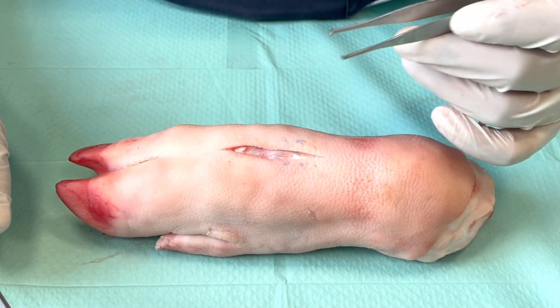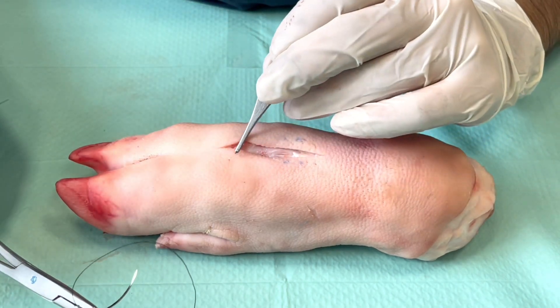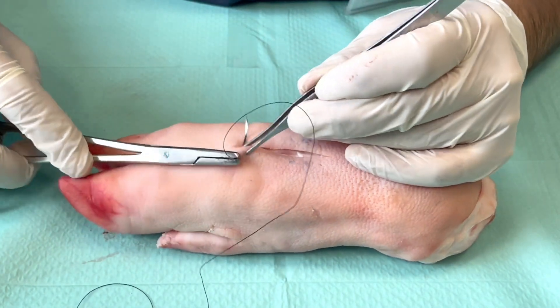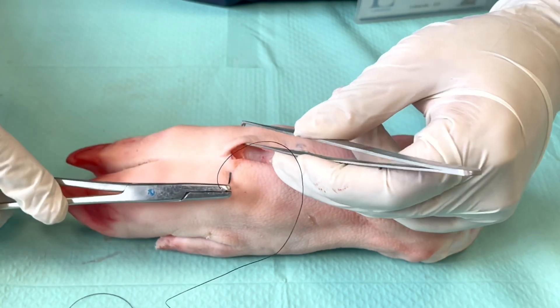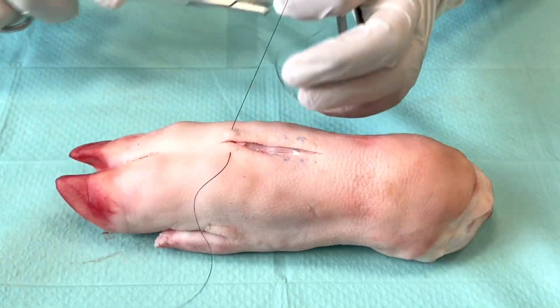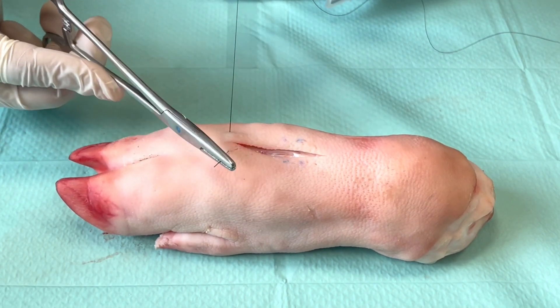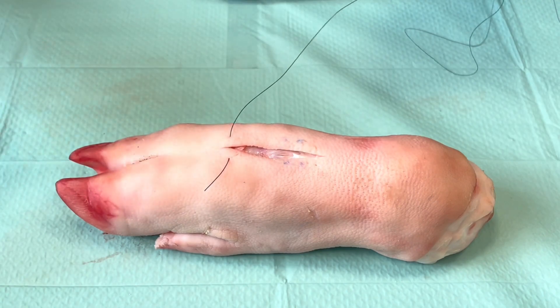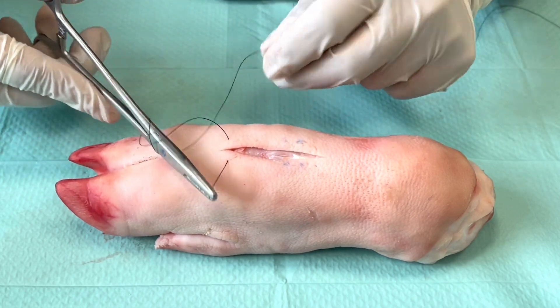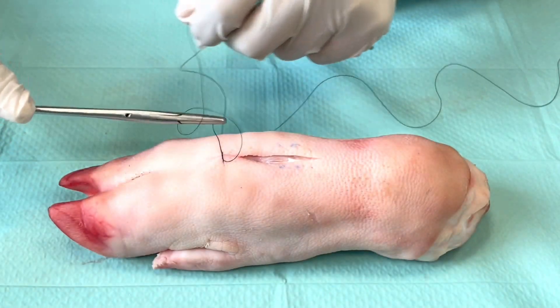Hello. In this tutorial we will show you how to do a simple running or simple continuous suture. We start off essentially the same way as a simple interrupted suture. You take your bites across the wound at about the same distance from the wound edge on both sides, pull up on the thread so that you get your short end and the long end, identify the V in between, and perform your instrument knot with two rotations on the first tie and then one rotation for the next two ties.